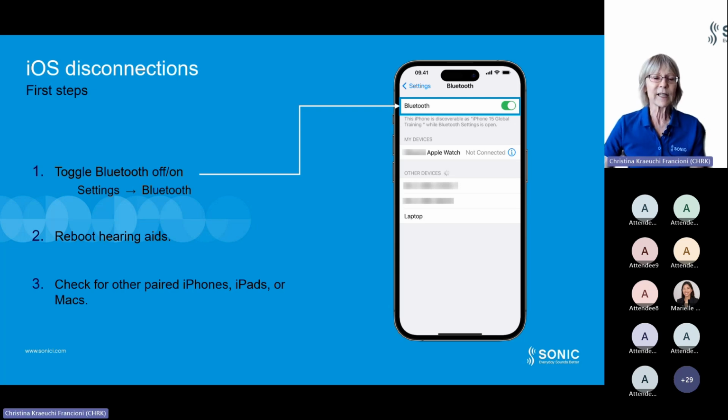Easiest is this for rechargeable hearing aids if the charger is in their proximity, so the client can just turn them off and on by inserting them into and removing them from the charger. And if the hearing aid has a traditional disposable battery, your client can restart them by opening the battery door. So these were just a few points to remind you how you can restart the hearing aids.